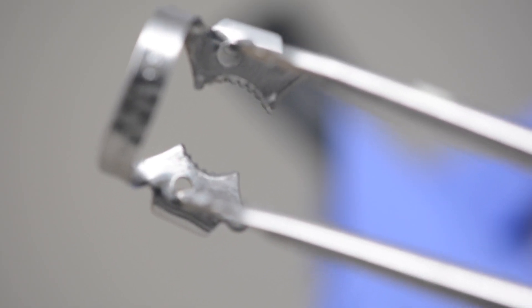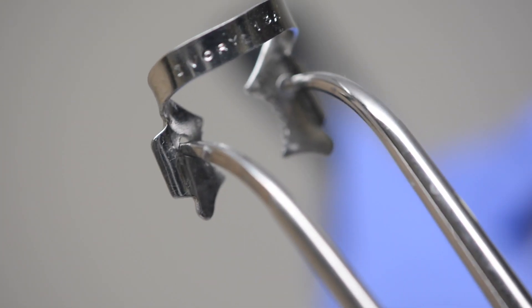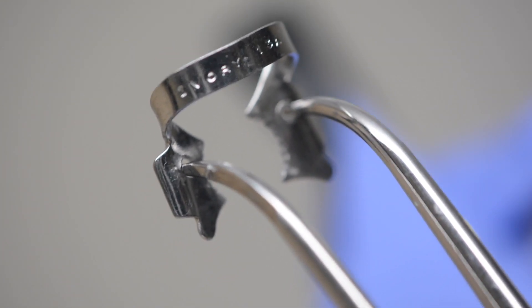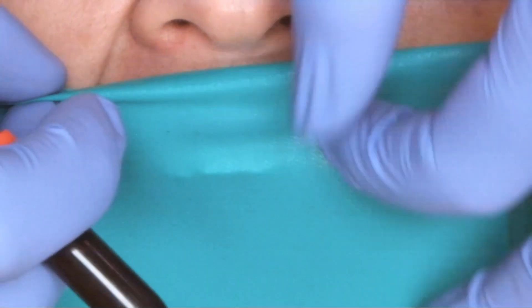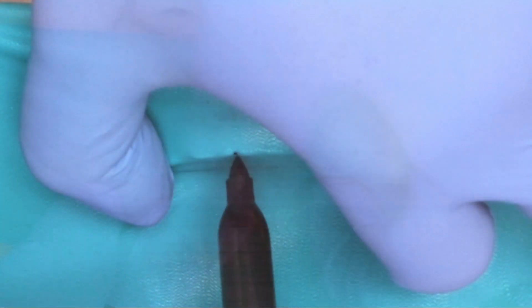Personally, I prefer a clamp with serrations to be able to comfortably grip the teeth with variations in anatomy, while the wings help give me slightly more retraction when working. I then create a custom rubber dam template. The prefabricated templates are incredibly helpful, but I find that they don't work as well with those teeth that aren't aligned in a perfect arch. I start this process by attaching the rubber dam to the frame, which allows me to stretch the rubber dam while my assistant marks the teeth.